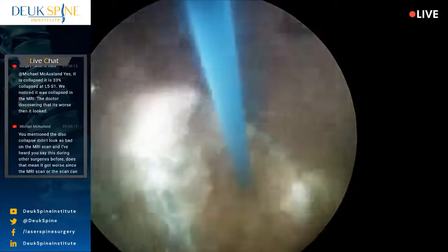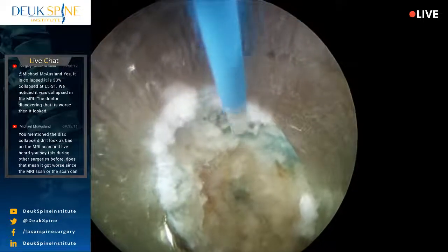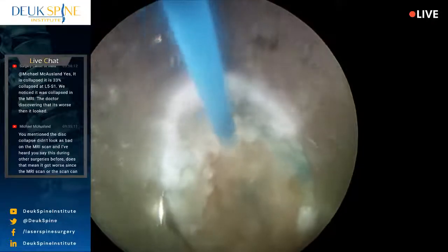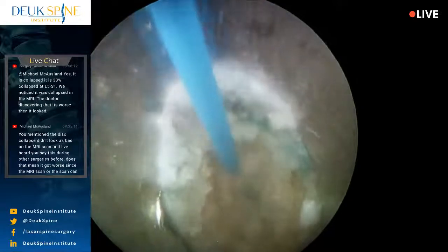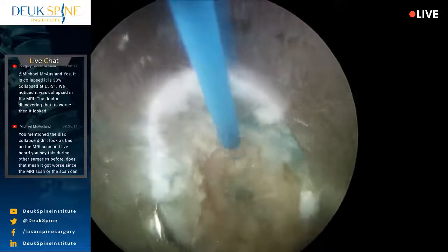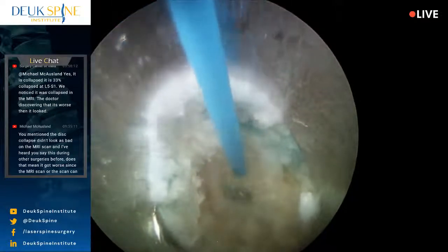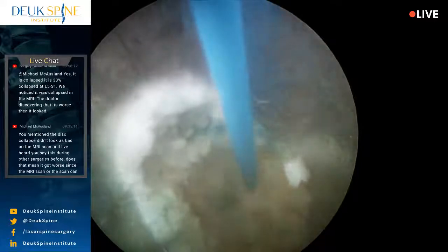There's a little bit of fat there. I'm just trying to get as medial. There's a little herniation medially, and I'm trying to get as much of that as I can, which I'm doing. And I can tell this is definitely a part of her pain problem because she's responding. Now, if tissue isn't painful, patients don't respond with a pain response, like wiggling their body or trying to get away from the pain, okay?